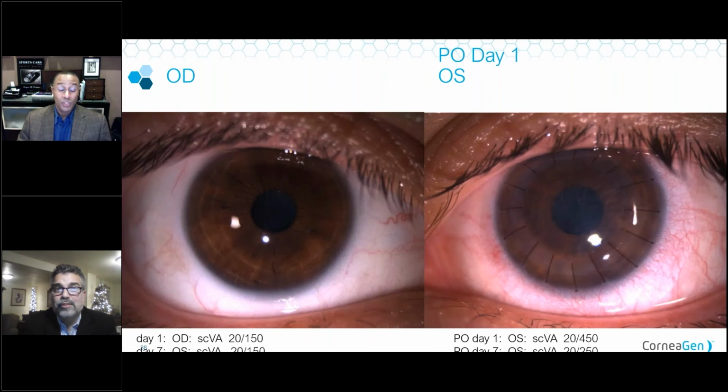So when we started, and we tore at that point, the tear did not buttonhole that cornea. Even at that 150 micron level, we were still able to get a stromal dissection at that level. Very good. And this is related to that as well.